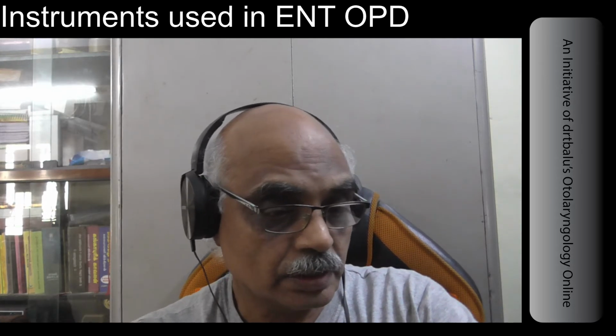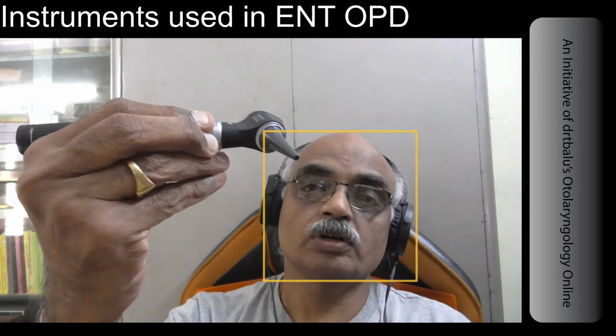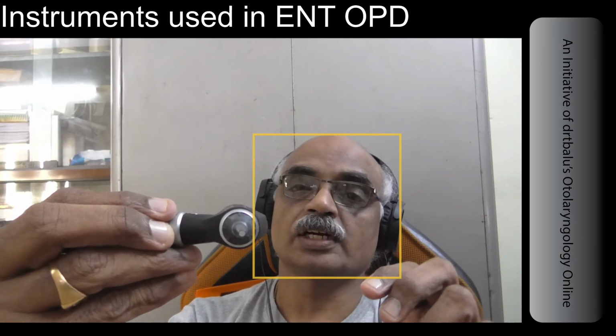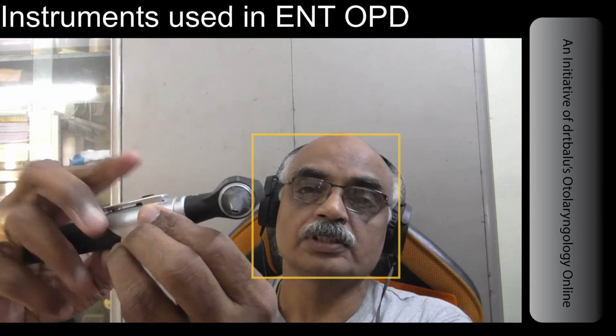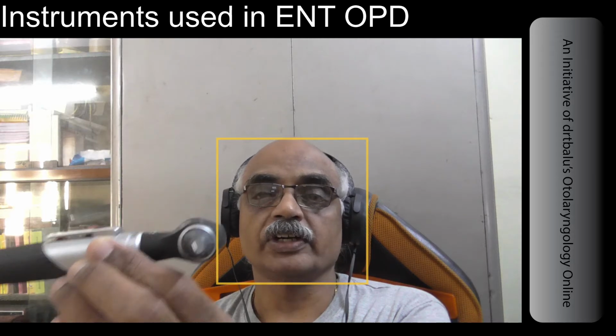The next is the otoscope. This is a commonly used OPD instrument to examine the eardrum of a patient. You hold the otoscope as you would wield your pen. This is the speculum, and it has an eyepiece. You view the eardrum using the eyepiece. There is illumination, so when you switch on, the otoscope will light up. The light will be at the distal end, so the entire ear canal will be brightly illuminated when you insert the speculum.